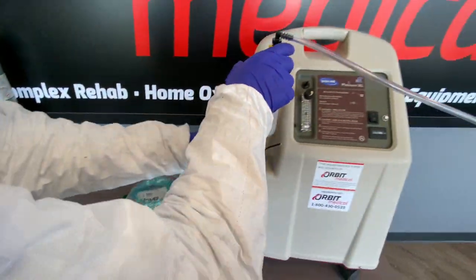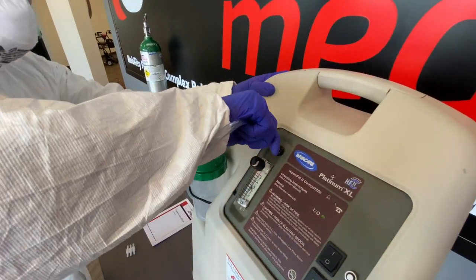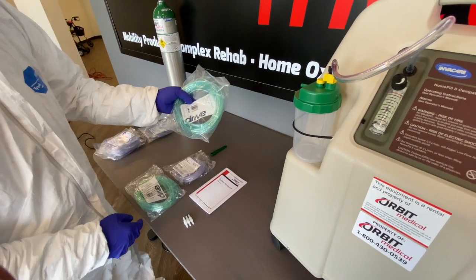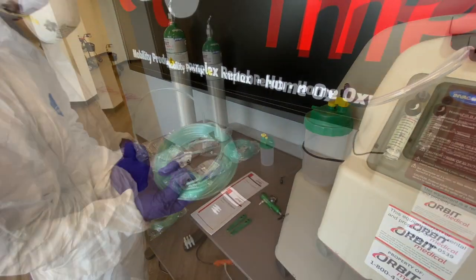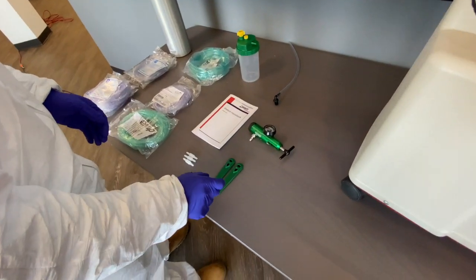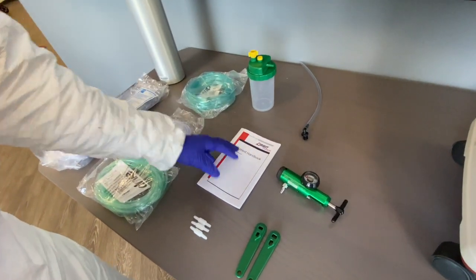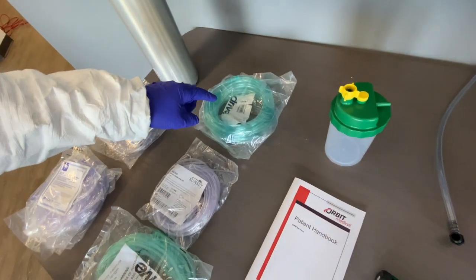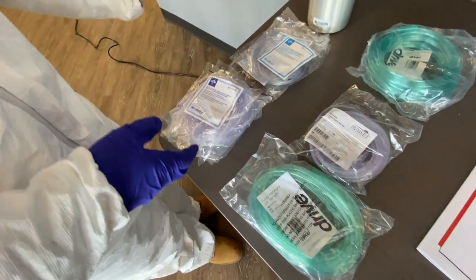I'll bring it over to the concentrator — this end will connect to the concentrator. I'll go ahead and grab the tubing; for this demonstration I'm grabbing the 40-foot tubing extension. In your kit you can expect to receive e-tank keys, your regulator, swivel connectors, a patient handbook, your humidifier bottle and connector, an extension tube 40 foot in length, a 15-footer, a 25-footer, and cannulas.